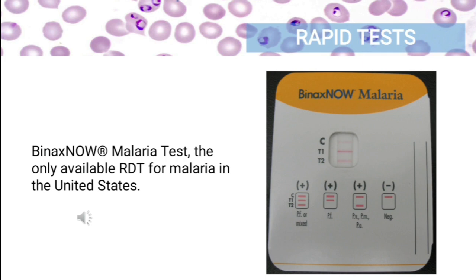Parasite lactate dehydrogenase or PLDH is produced by the asexual and sexual stages or gametocytes of the malarial parasites. Test kits are currently available to detect PLDH from all 4 species of Plasmodium. They can distinguish Plasmodium falciparum from the non-falciparum species, but cannot distinguish between Plasmodium malariae, Plasmodium ovale, and Plasmodium vivax. Tests that can detect PLDH do not generate persistent positive results following chemotherapy like the HRP2 test.